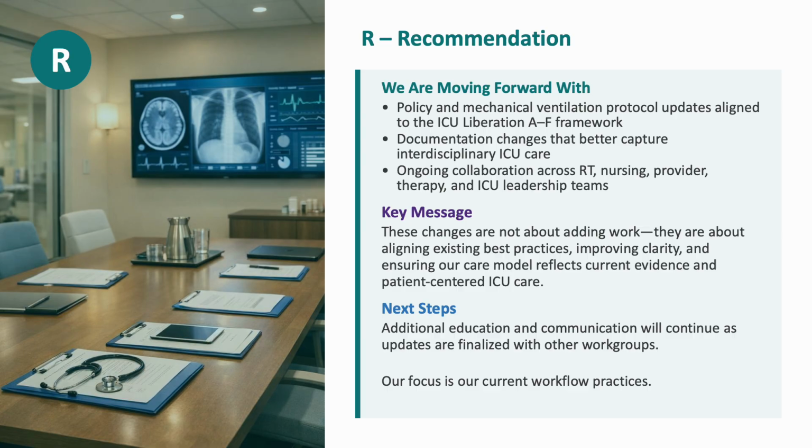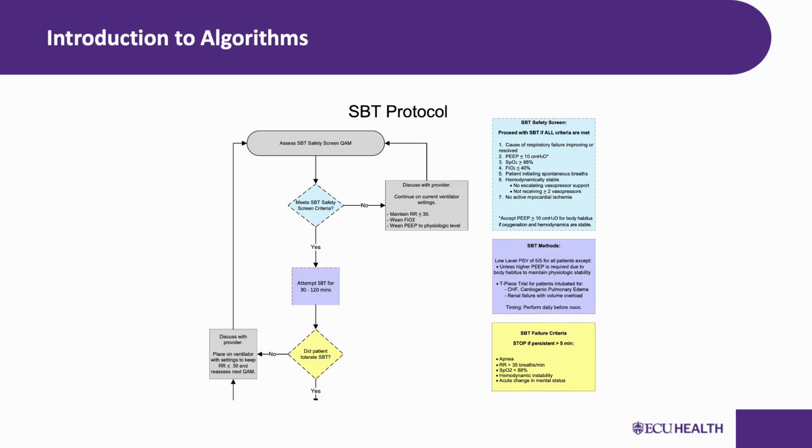So let us transition now into the actual protocols. We're going to start with some orientation to how these flowcharts work, and then we're going to dive into each one. All right, before we jump into the actual protocol algorithms, I want to take a minute to orient you to how these flowcharts are laid out, because understanding the visual structure is going to make everything that follows much easier to follow.